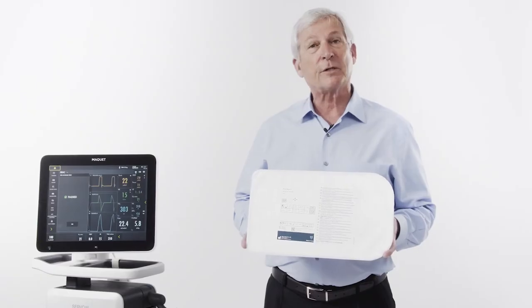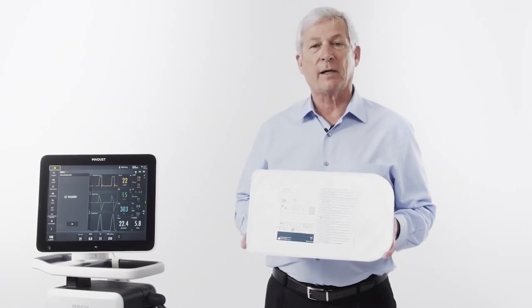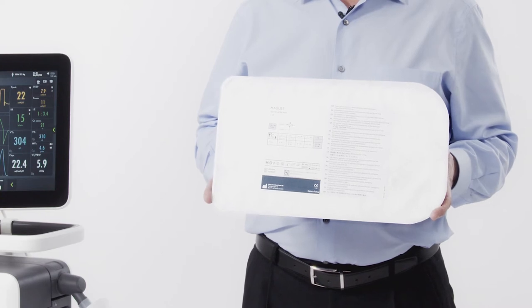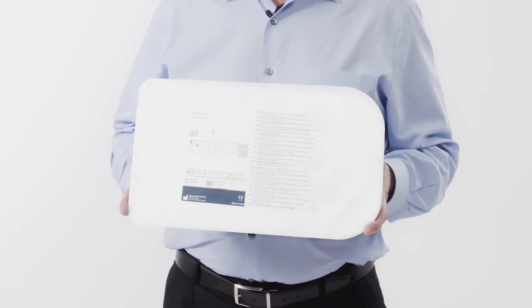It's now time to pick the proper catheter size. In order to do this, you will have to know either the height or the weight of your patient. The length of the catheter has the electrodes in different places. This will be important to transmit a proper EDI signal from the diaphragm to the ventilator.